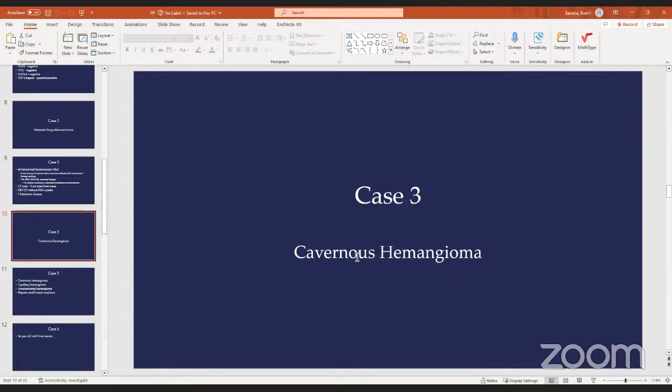It's only nowadays that we see a lot of them because of the lot of imaging that goes on, because of tumors, and as in this case, there might be an alarm for metastatic disease. So we do see them on biopsies quite not infrequently in current practice, and that's because of follow-up for tumors. But in the past, they were mostly discovered at autopsy, and they obviously do no harm to the patient.